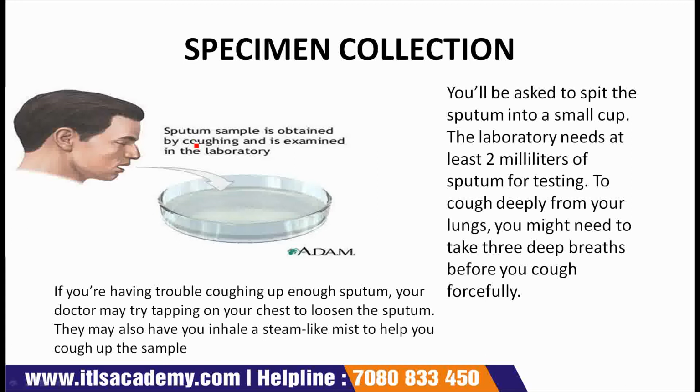Here collection of specimen is shown. You can see sputum sample is obtained by coughing and is examined in the laboratory. Sputum is taken from direct cough and it is taken in particular media, and after that the collected sample is tested in laboratory.